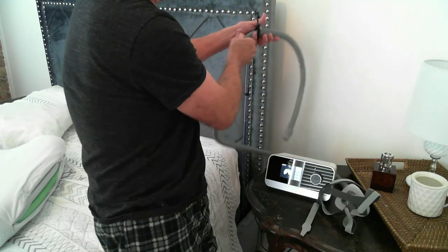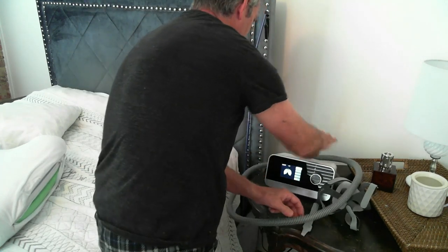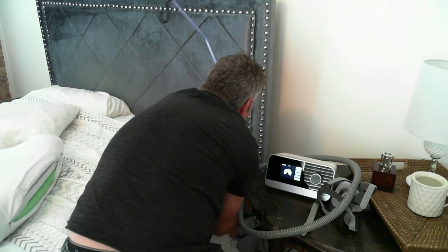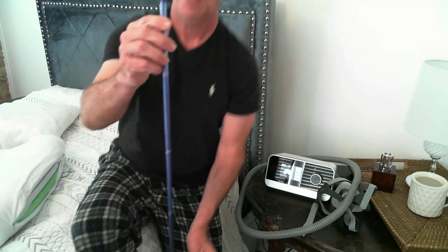The CPAP hose lift is easily transportable. I'm going to show you how to take this hose lift apart and give you a better look at it. Let me get it out from under the mattress so you can see the whole thing.